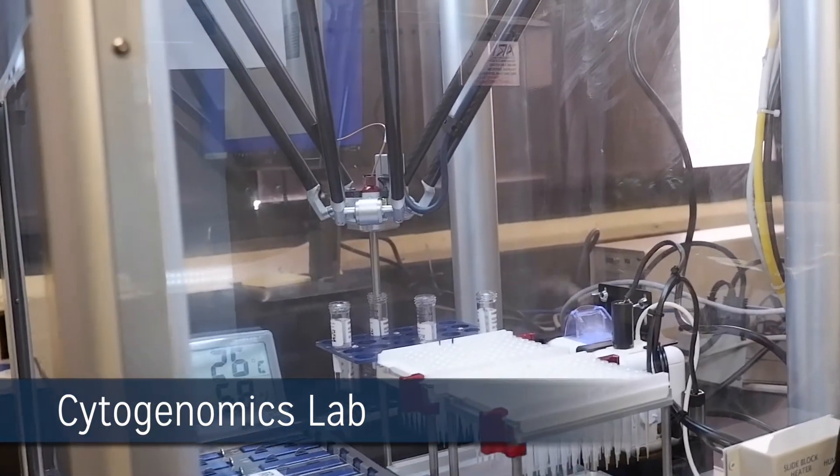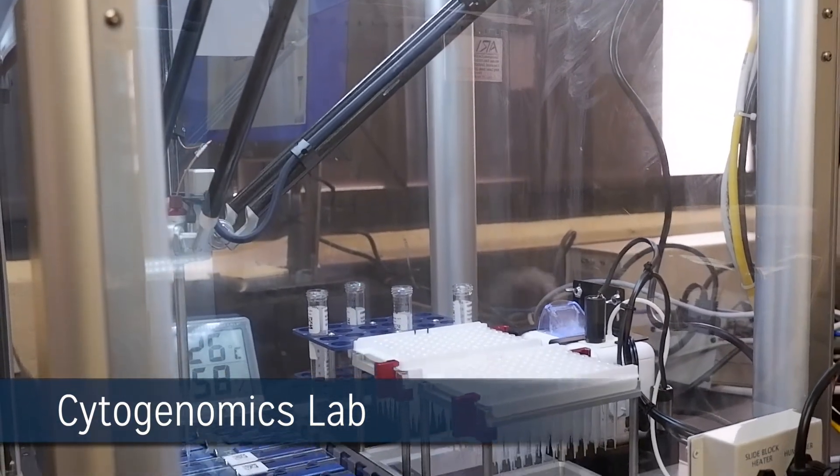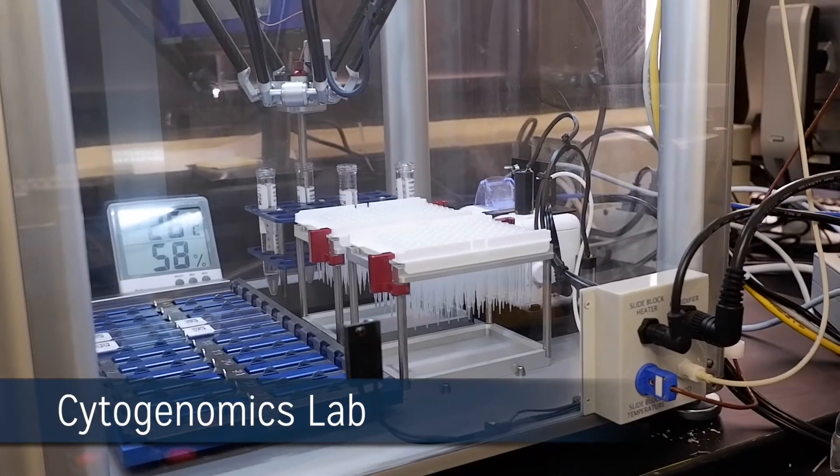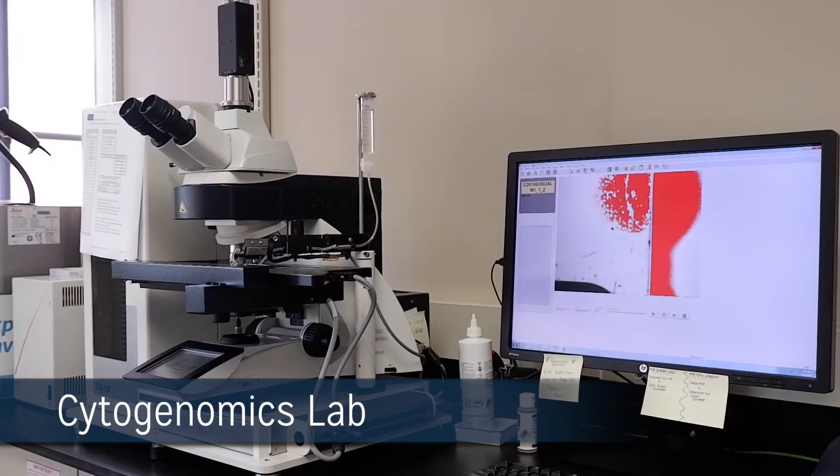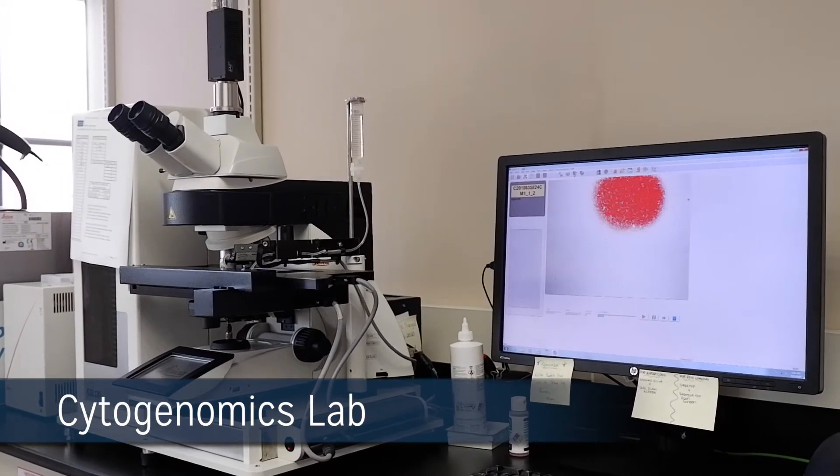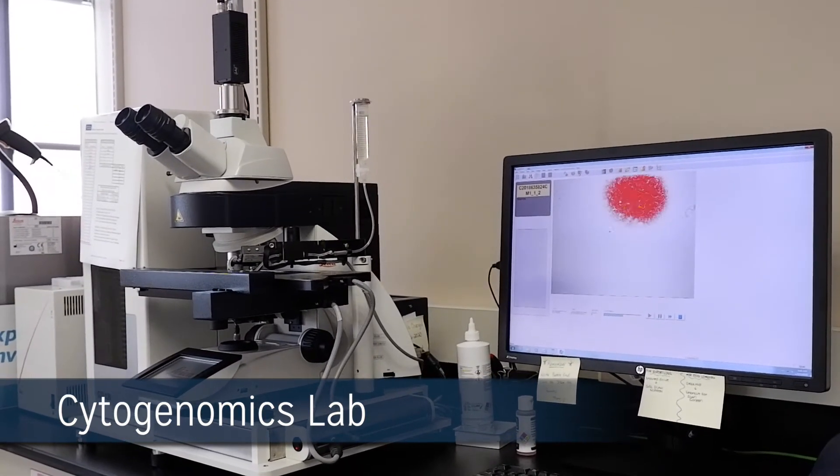The slides are stained using an automated slide stainer. Then the metaphase cells are digitally scanned using the Leica Biosystems GSL metaphase scanner. The automated cell finder and imaging station captures and enhances cells, providing the technologists with hundreds of cells for analysis.